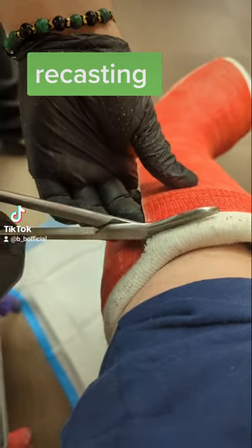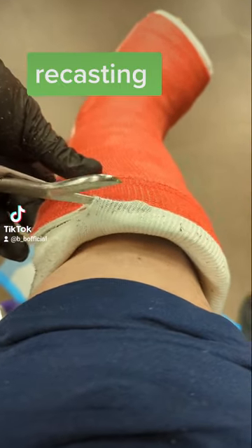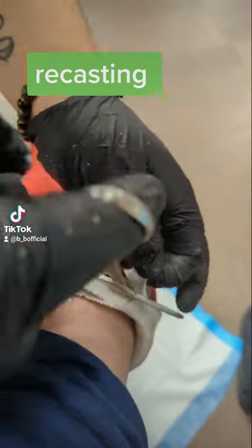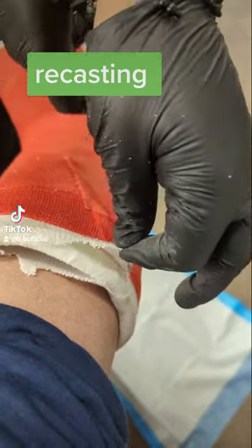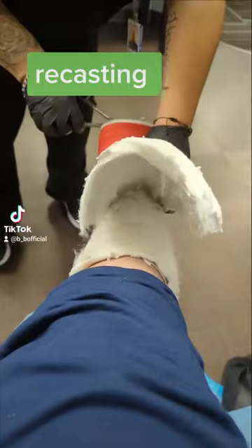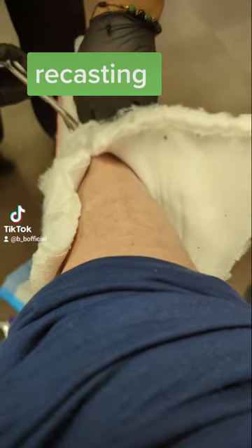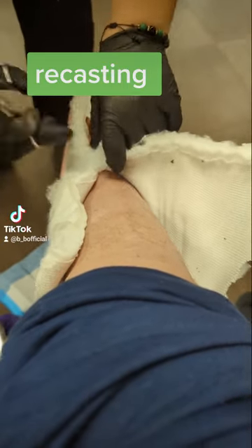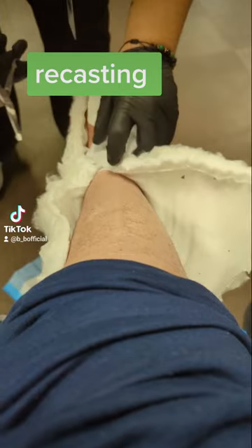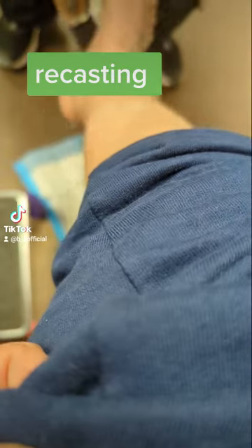They are taking this cast off and putting me in another one. This is the procedure — he first used some kind of saw. He took off half the cast with the saw and now he is cutting the rest of it.